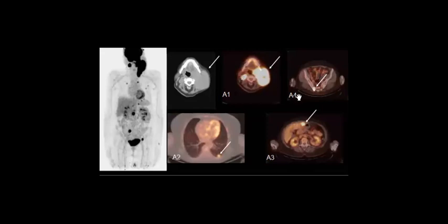Okay, and you can see this in the, where is the site here? Can you describe it? Yeah, it is a bony mets. Could you characterize the location? Right iliac. You remember our case last time? We took one case and we discussed it. It was a long case. Do you remember? Try to remember and maybe it gives you a clue.